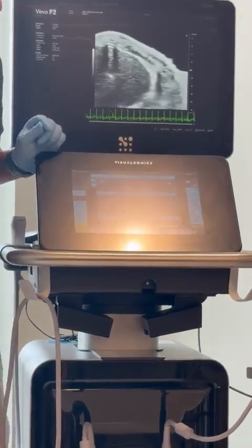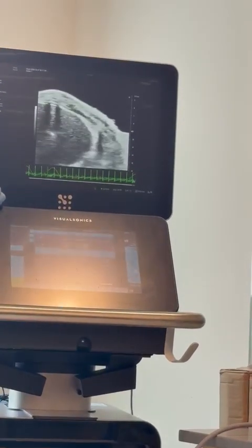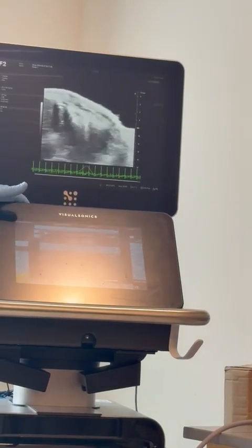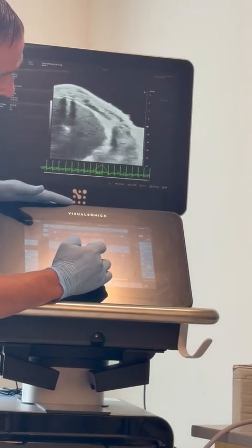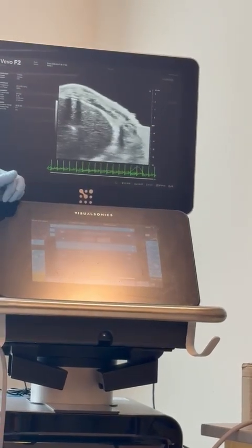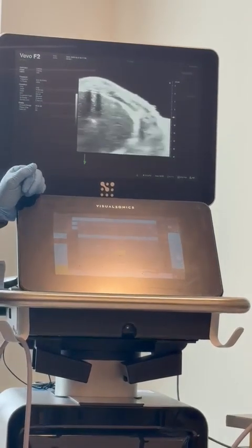The only other thing we need to change on here is my step size. My step size will determine how long my scan is. So I can do as small as 40 micron step size. So a better acquisition, a nicer image, but you're going to sacrifice time. We're going to increase our scan to about 200 microns, and that's going to be about 1 minute and 50 seconds. Okay. So once I set that step distance, I'm just going to hit scan.